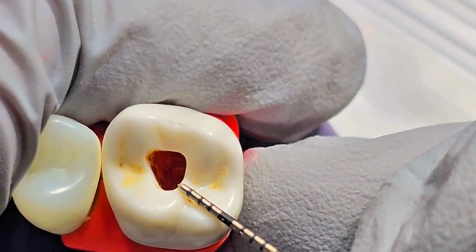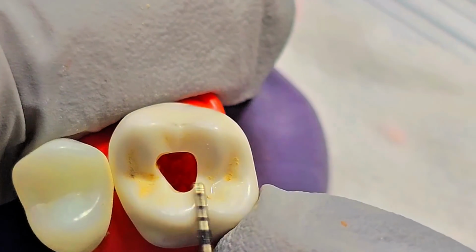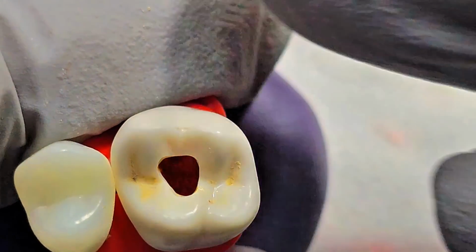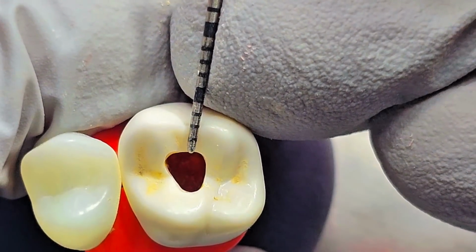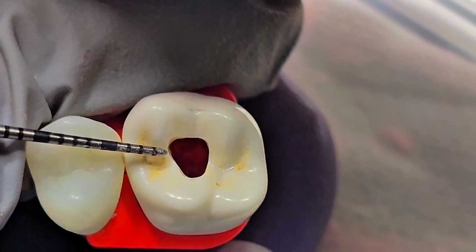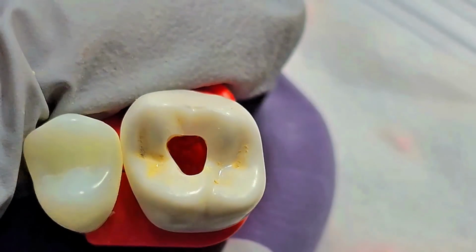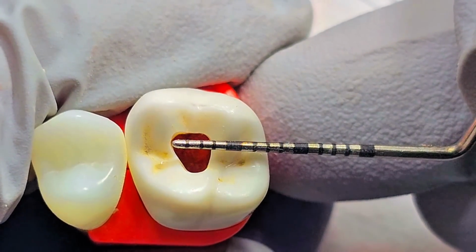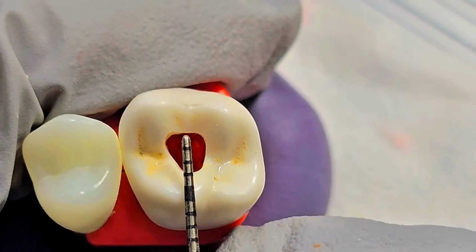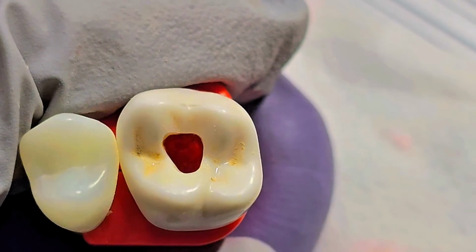Okay, because the end of the black is the 1 millimeter, and here we have about 2 millimeter, 1.8, and from here we have 2 millimeter or 1.8, and from the mesial margin we have about 2.7 millimeter or 2.5 millimeter, and mesiodistally we have 2.8 millimeter, and buccolingually we have about 3 millimeter. Whew, good. It was okay, right?